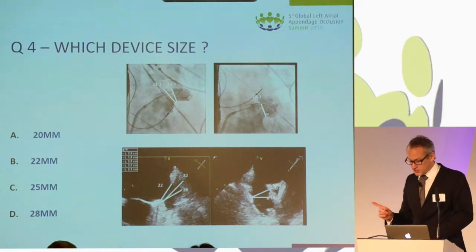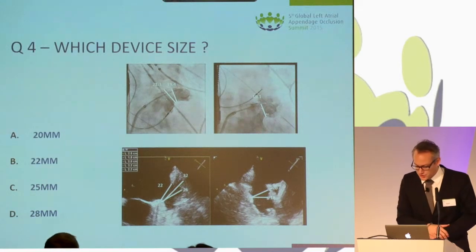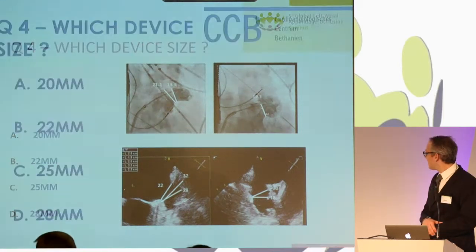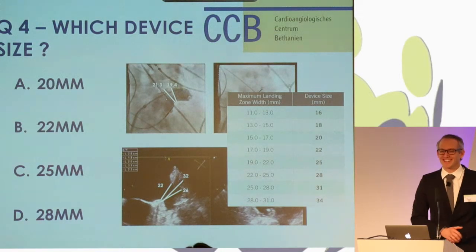I have the sizing chart again, but it's a different slide, so I cannot show it to you. Let me see. Here it is, if you want to see it once more.